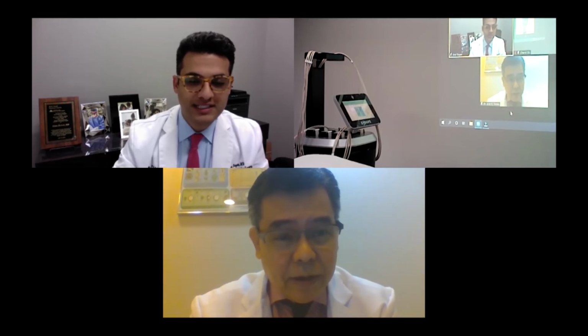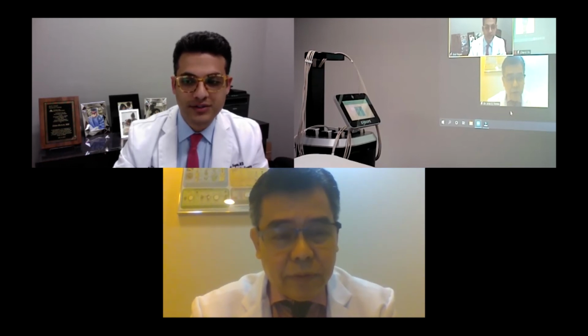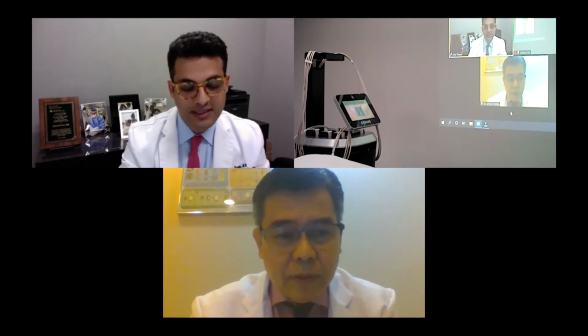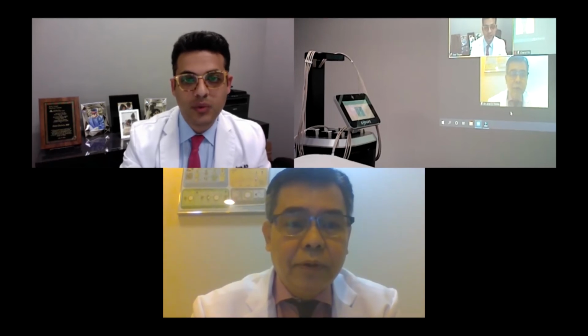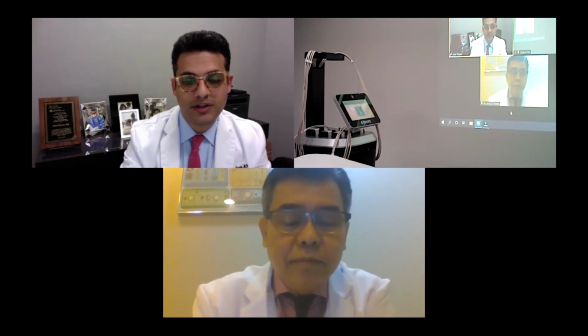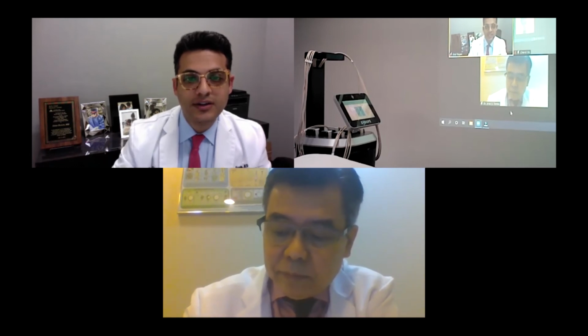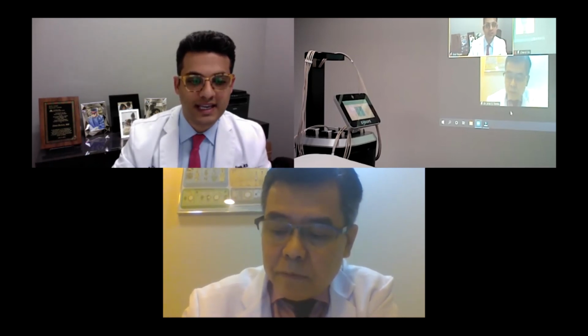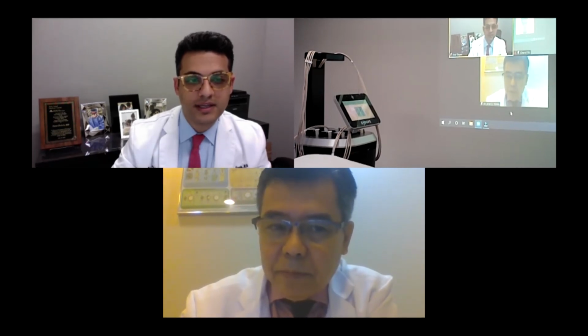Great question. We actually did a study. When I present our data on radiofrequency, there's always a plastic surgeon who asks what happens to lymphatics and what happens to perfusion. We published on this in the Journal of Plastic and Reconstructive Surgery. Interestingly, this has been shown in lymphedema, where there's lymphatic obstruction. Heat triggers a proliferative cascade and produces neoangiogenesis and neolymphangiogenesis. I'm going to show that to you here with our Morpheus device because it's a great point.